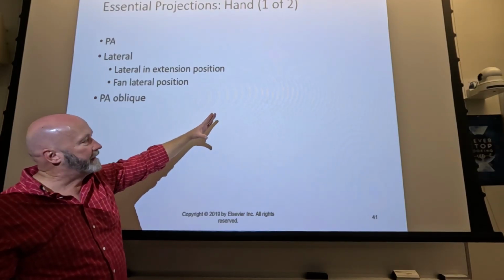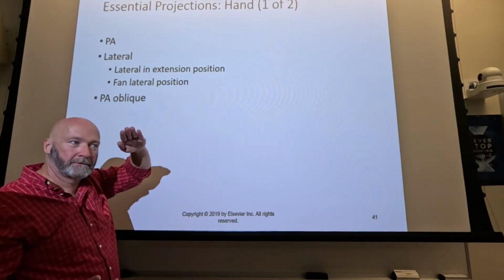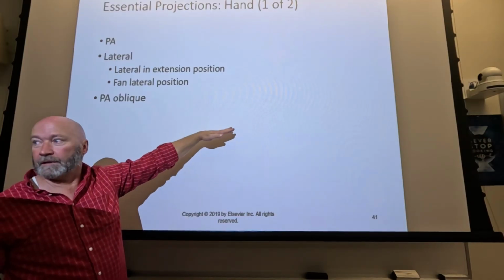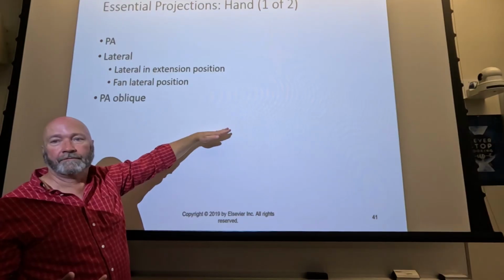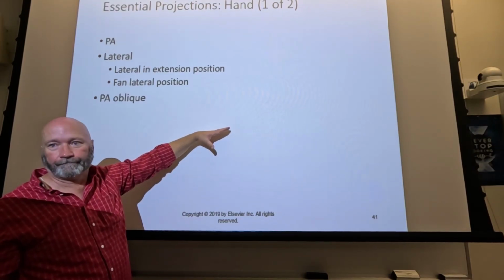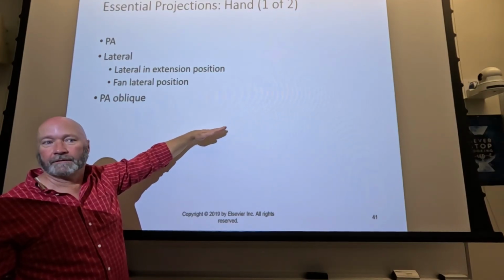So a couple of things about this is you're gonna have a tendency to tell the patient, I want you to put your hand up there like a karate chopping something, right? And this is exactly what they're gonna do, okay? So how much do you have superimposed here? You've got a lot, and if you do this, you got more, right?